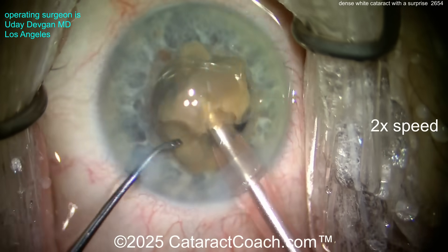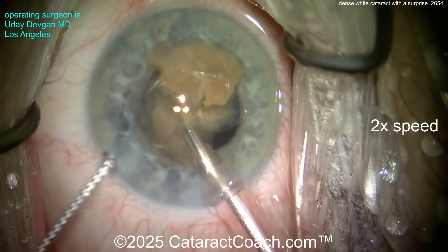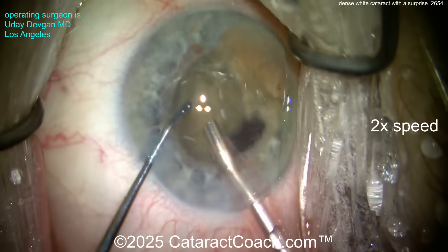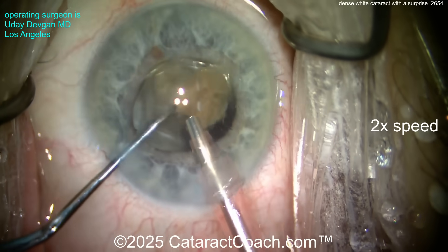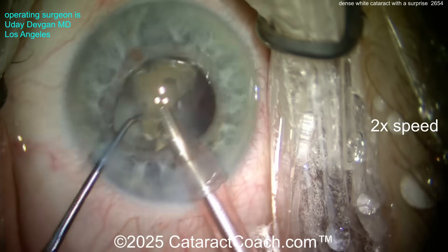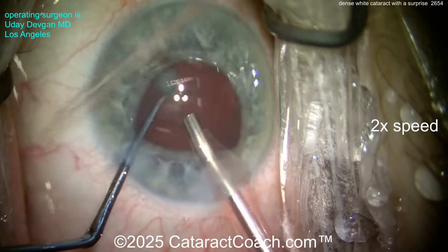The patient even had some sensory exotropia — hasn't seen out of that eye in that long. Now we're going to recoat the endothelium with dispersive viscoelastic — look at that recoating the endothelium. Going back in to take out these last few pieces. The first surprise was obviously the fibrotic lens capsule, which we didn't see easily at the slit lamp preoperatively, but once we had trypan blue dye it was pretty clear. But there's still one more surprise coming.